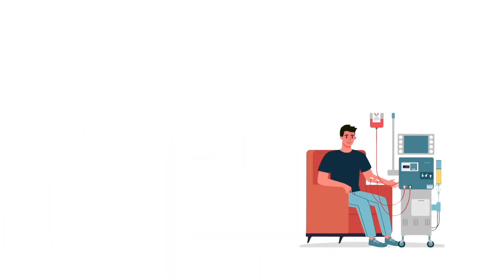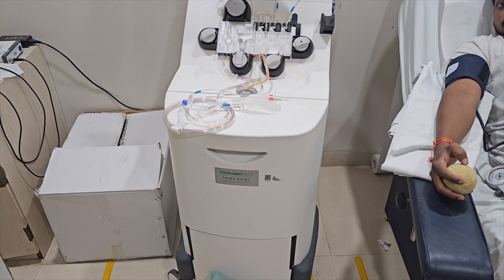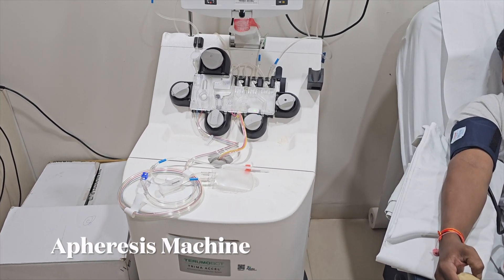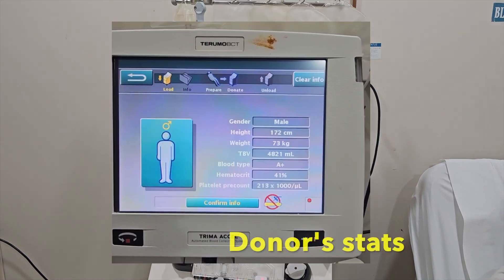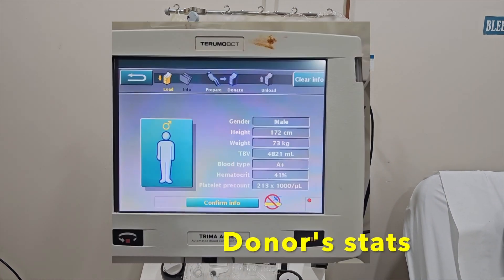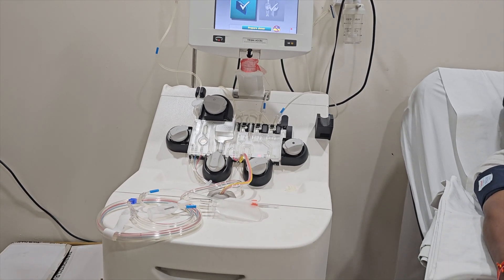SDPs are prepared in the apheresis machine, wherein platelets are removed along with some plasma, and RBCs are returned back to the donor. This is the apheresis machine with sterile disposable circuits.